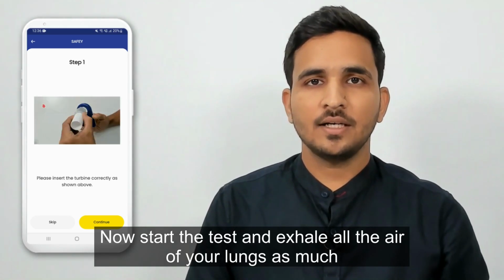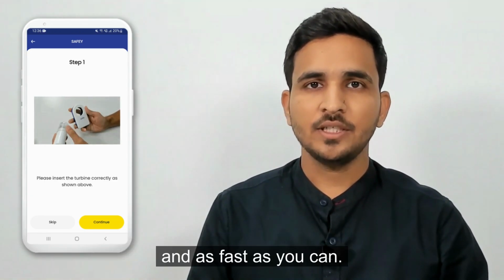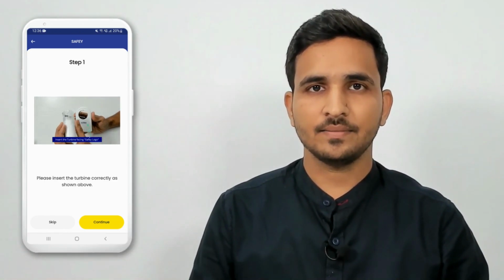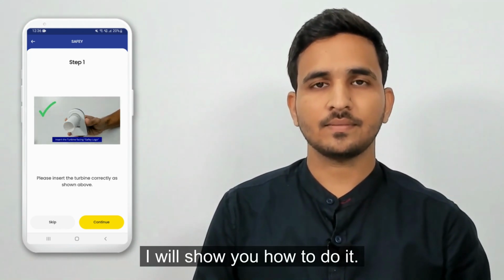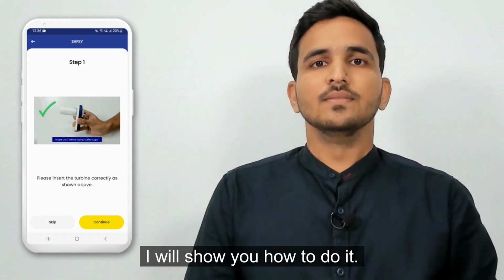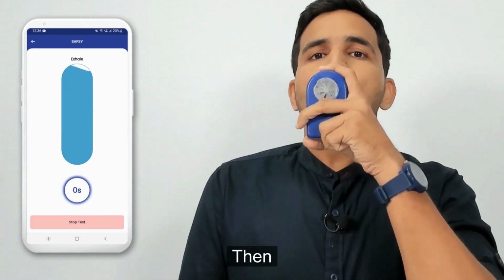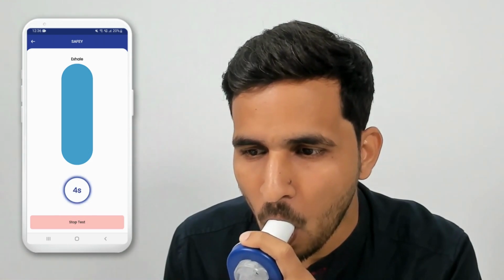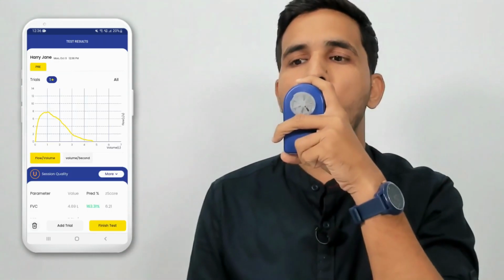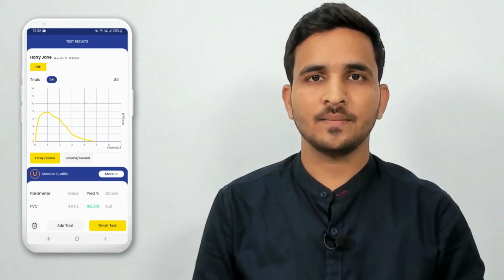Now start the test and exhale all the air of your lungs as much and as fast as you can. I will show you how to do it. And then you just need to wait for the results.